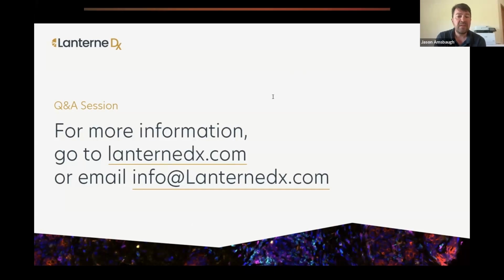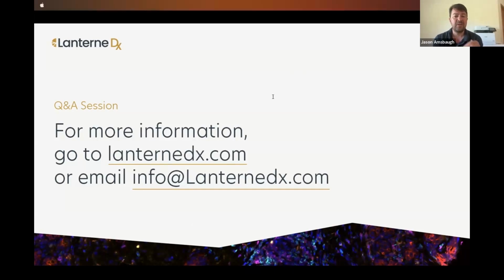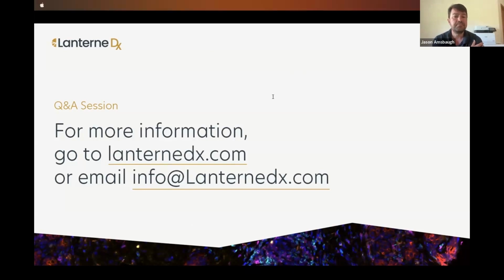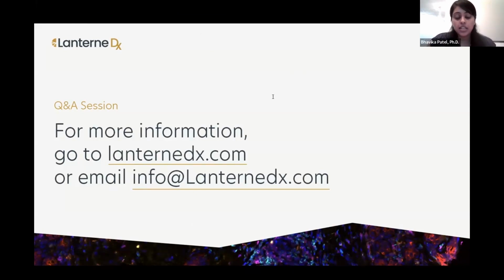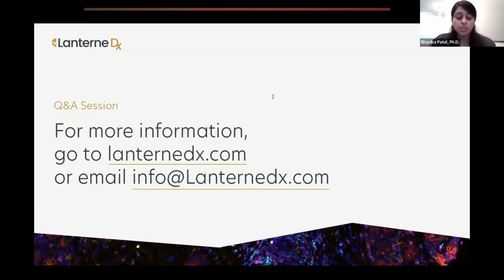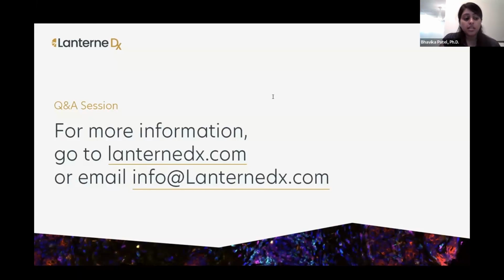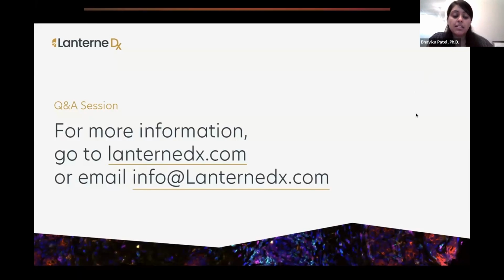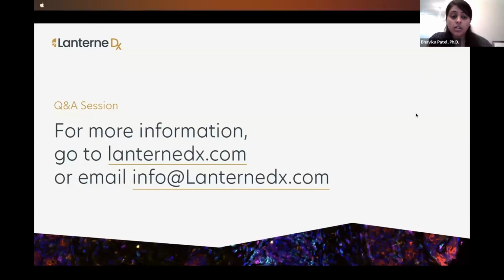The next question is, can multiplex immunofluorescence be used as a diagnostic tool? Great question. It can't be used right now as a diagnostic tool, but I do think that it is heading that way. Multiple laboratories have utilized multiplex immunofluorescence to report prognostic or even predictive values of immune subsets in several types of cancers, but it hasn't been used in clinical settings thus far.